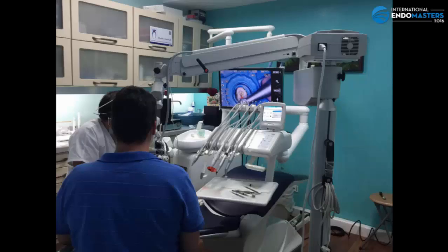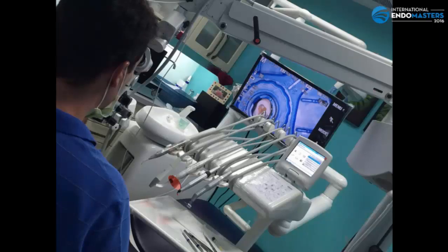It is very important to use magnification because at least 50% of the second maxillary molars have two mesiobuccal canals. You can see in this image the champagne bubbles coming out from the vital tissue in the MB1.